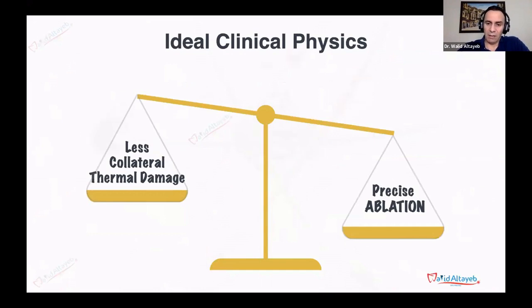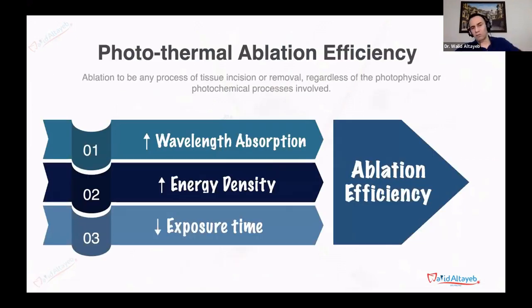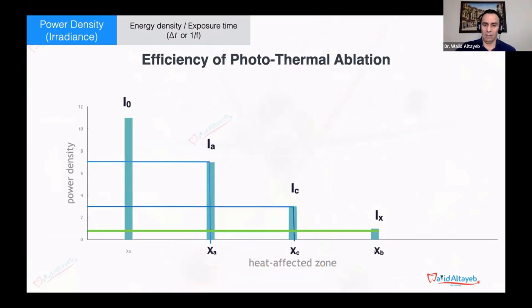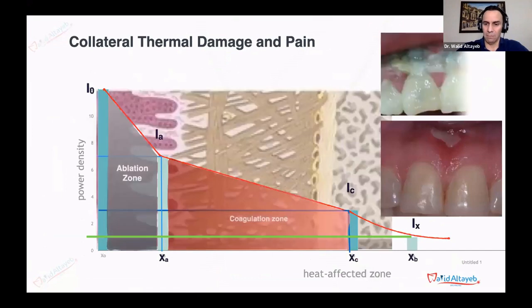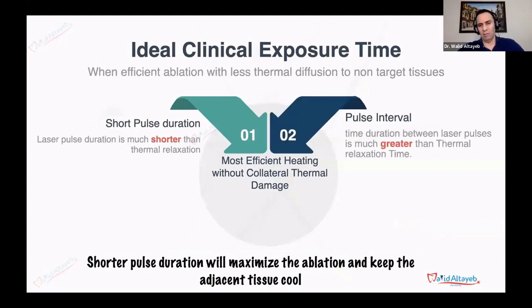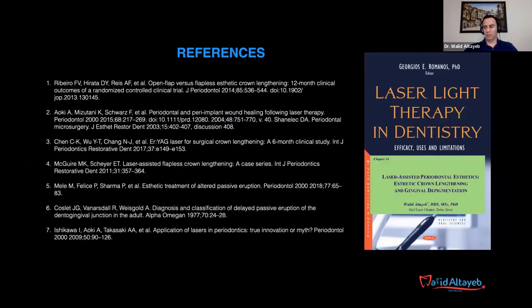But of course, again, at the end, you need to know how to do this procedure, how to get the precise ablation without causing thermal damage. This is how to pick the correct wavelength, how to use the correct setting to avoid any damage, especially when you are dealing with the bone. Because we don't want to end up with cases like this, especially this happens with diode if you don't control it, if you don't choose the correct setting, for example using the continuous mode with diode is dangerous because you don't give the tissue the time to relax.